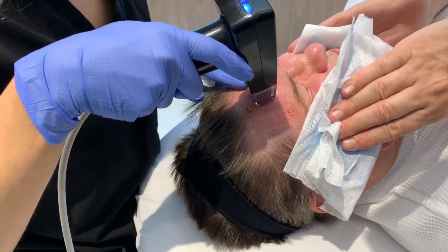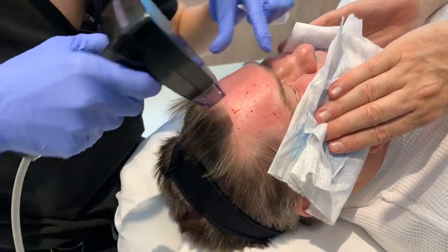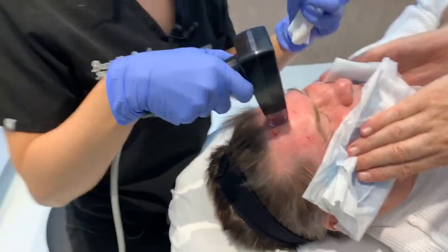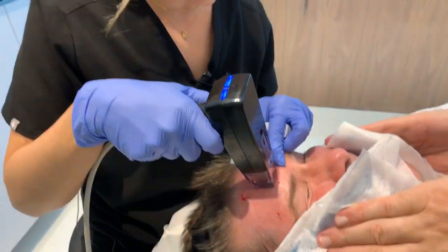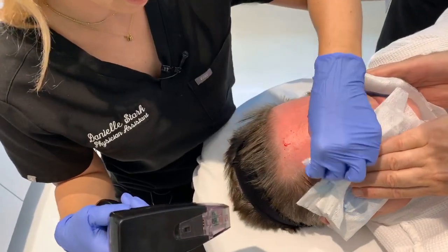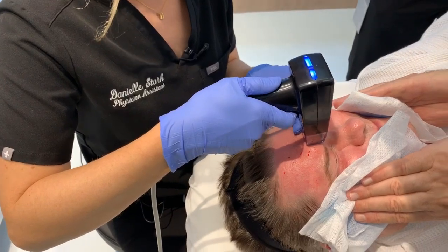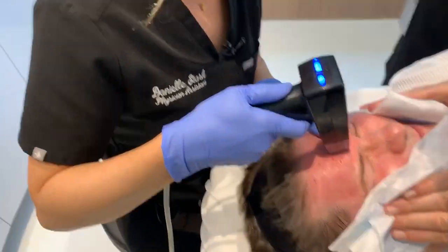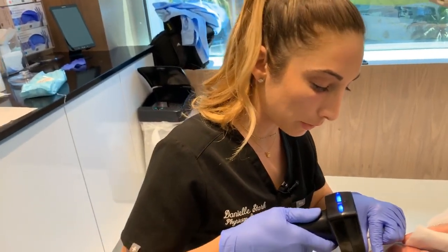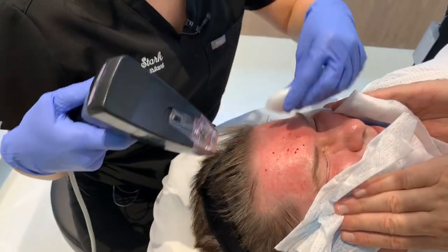Do you want to tell us what this feels like? Can you describe it? For 1 second it hurts and then it goes away. It is like a little prick. You can feel some of that energy kind of coming into the skin, and we can push this energy quite deep. So the RF is great for skin tightening, and it's great for anti-aging, but it can be a little bit uncomfortable. So with this treatment, we do topical numbing, and that's typically enough. We can also do nerve blocks, and this is something that we combine with other treatments quite frequently. So we'll use whatever measures are needed for that.